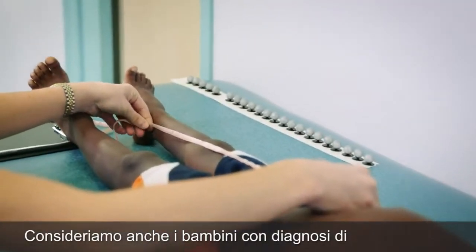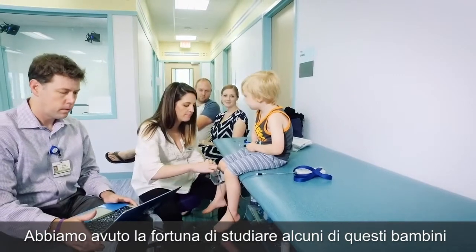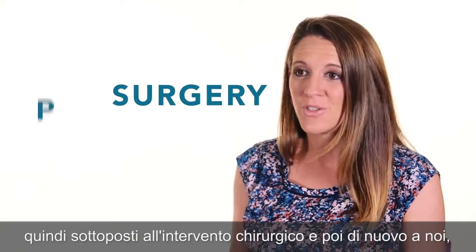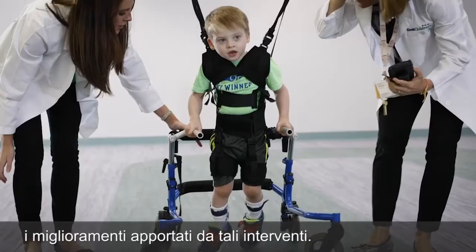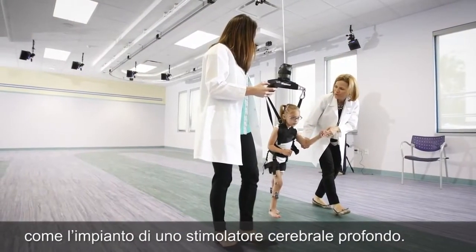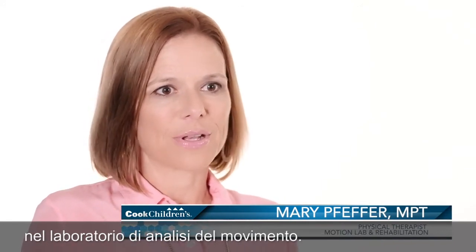We are also considering children with a diagnosis of muscular dystrophy, hereditary spastic paraplegia, children with dystonia. We've been fortunate enough to study some of these children prior to any kind of surgical intervention, then have them have the surgery, and then return to us so that we can objectively measure the improvements that were made by those certain interventions. We have been evaluating children pre- and post-surgical interventions such as a deep brain stimulator. It will add greatly to the literature on the deep brain stimulator, as well as the capabilities of what we can do in a motion analysis lab.